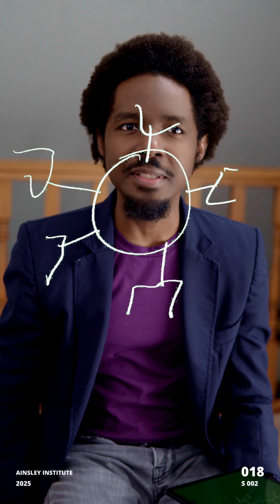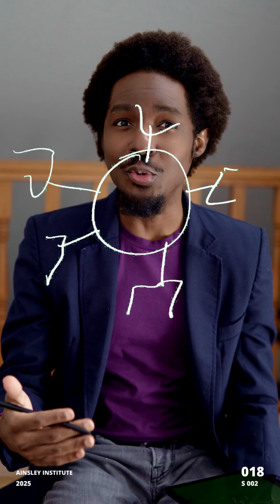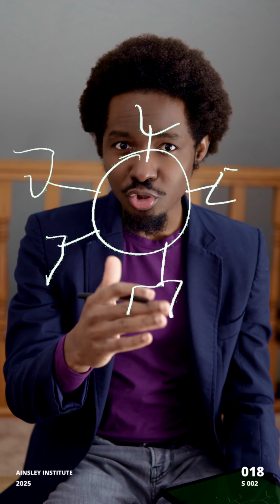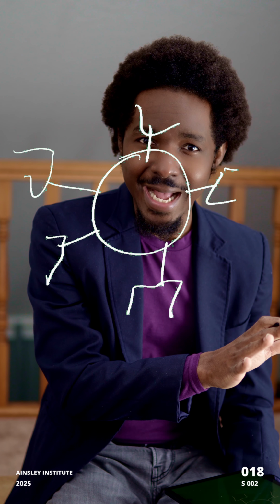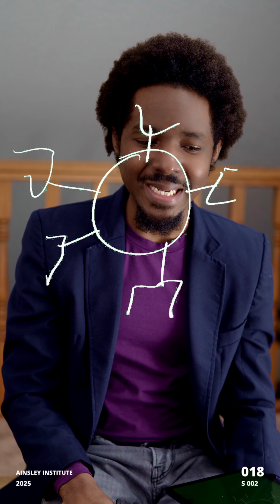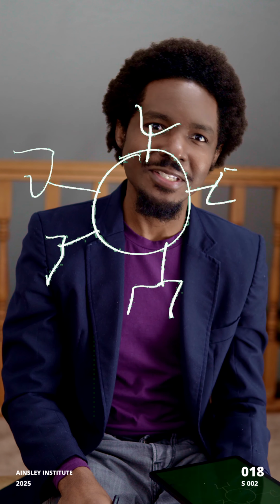So these two blood grouping are still a part of the ABO blood grouping system, and that is just one blood grouping system. There are other blood grouping systems that are implicated in transfusion reaction, but they are not necessarily identified at room temperature. They have to be taken through some other testing methodologies to determine compatibility, and we are going to go into those in a little while, but we just want to focus on the ABO blood group system.